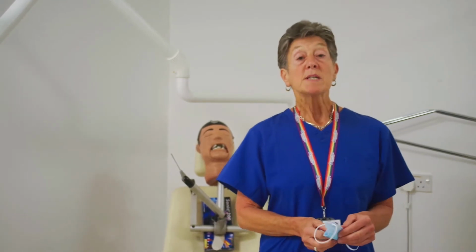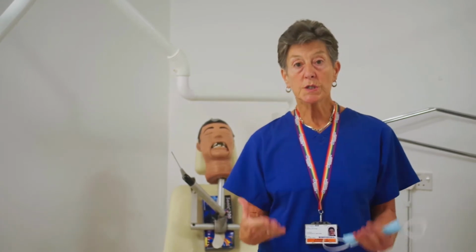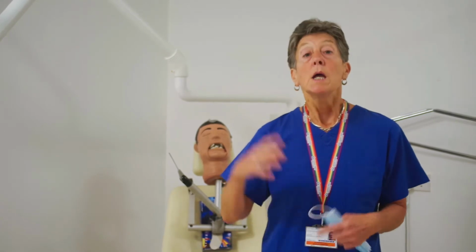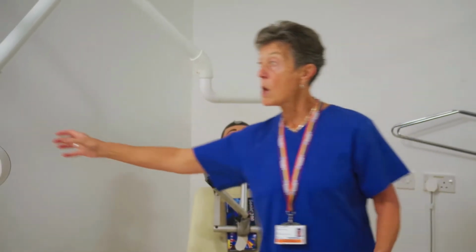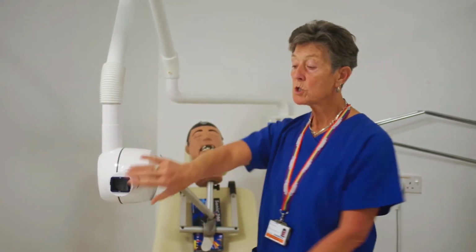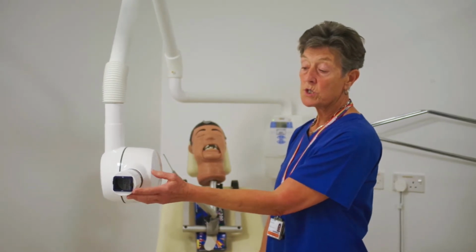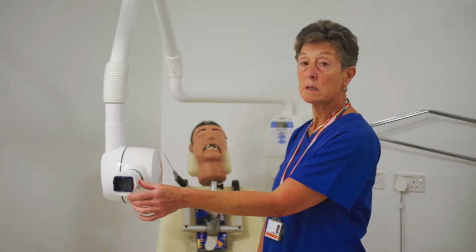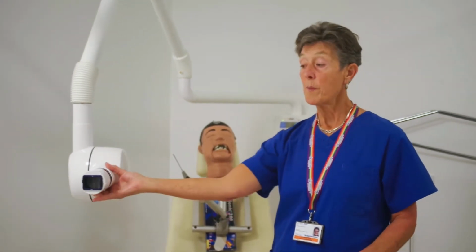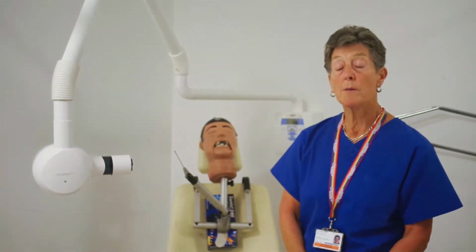Now, when we're talking about limitation, what we're trying to do, as Mark alluded to, was to reduce the doses of the patient. And we do this in a variety of ways. He talked about the only place that the radiation comes out from the X-ray tube is from here. And if you notice that on the end of this X-ray tube we have a rectangular collimator. This reduces the amount of radiation received by the patient, and it's also in the approximate shape and size of an image receptor.